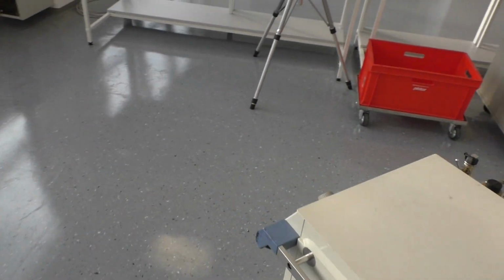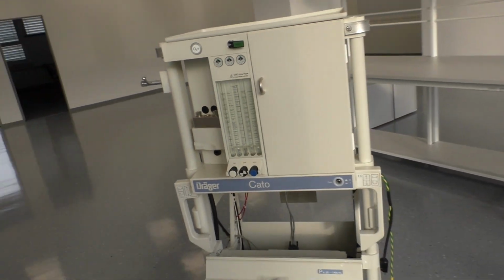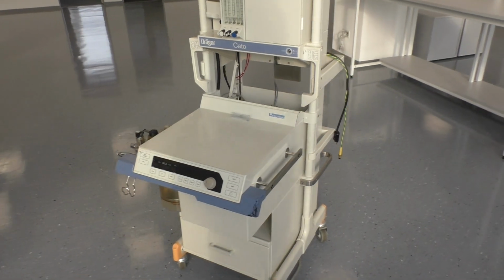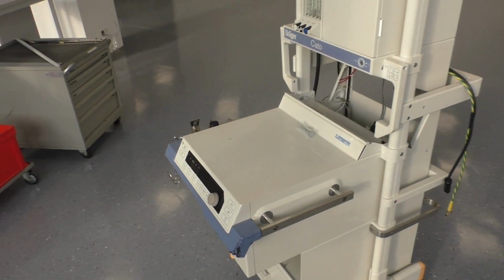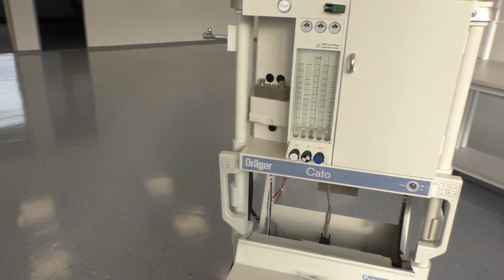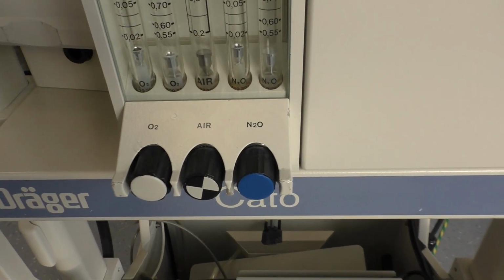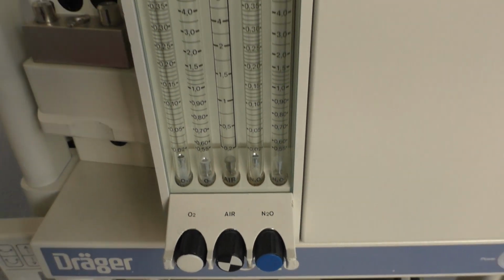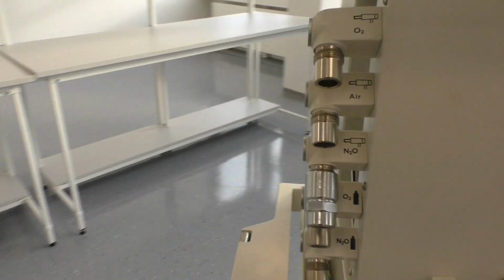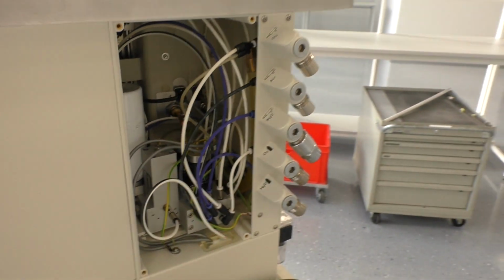And that's basically the machine that makes you sleep when a big operation, surgery, is planned. So that machine mixes oxygen, air and nitrous oxide together in the right proportions to make the patient sleep very deep without feeling any pain.